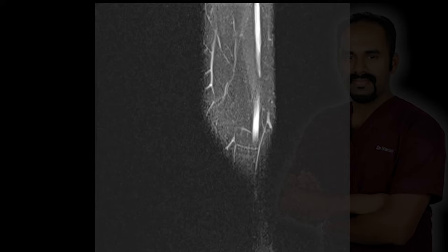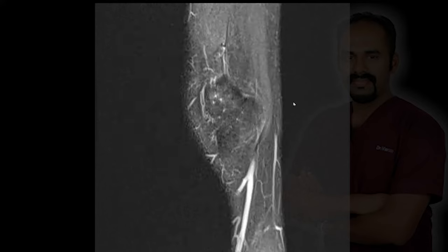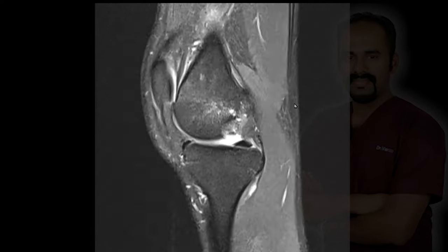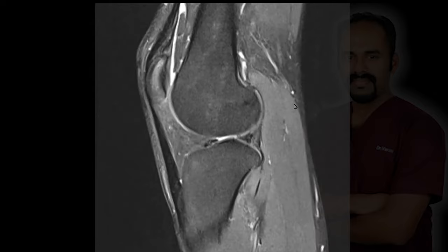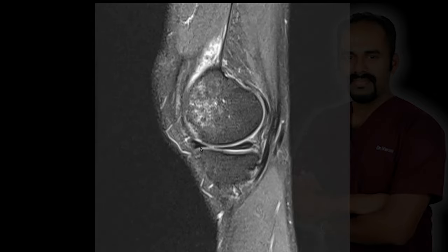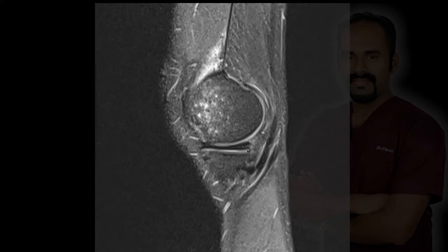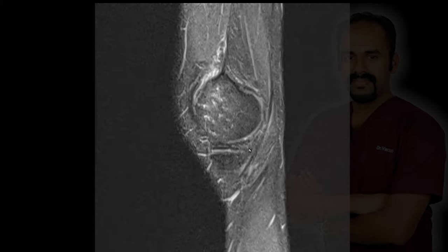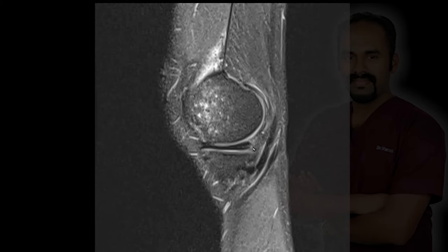24-year-old male to rule out internal derangement of the knee. Sagittal PD fat-saturated images starting from the medial aspect going towards the lateral side. The anterior horn and the posterior horn of the medial meniscus appear relatively preserved. Just in the periphery of the posterior horn there's a little bit of high signal intensity, but no obvious signal changes extending to either of the articular surfaces.